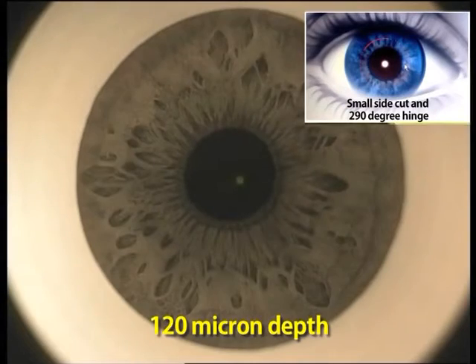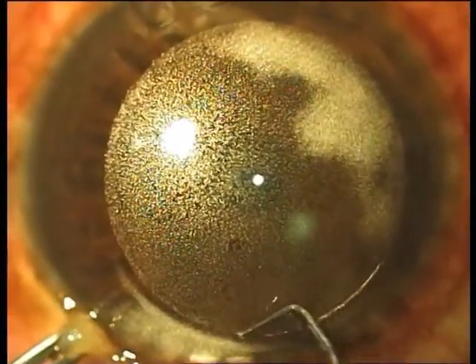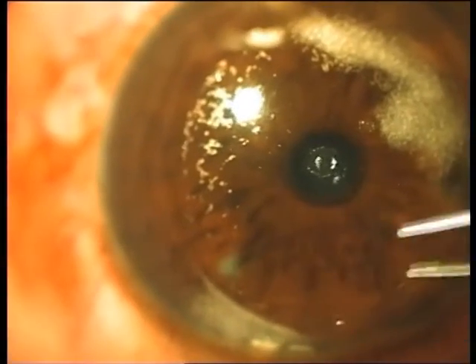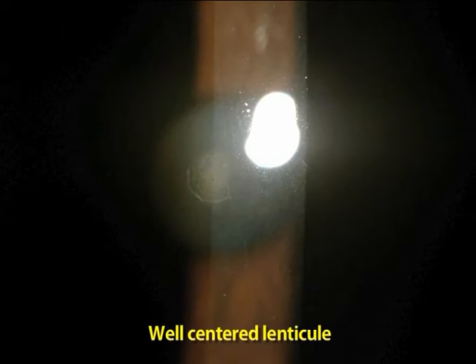The coaxially sighted light reflex of the presbyopic patient's non-dominant eye is then marked, and a flap is created with a large hinge and a very small side cut that allows the creation of a pocket. Once this is done, the pocket is dissected and the 1 millimeter PEARL inlay, which can be seen here, is implanted on the coaxially sighted light reflex.